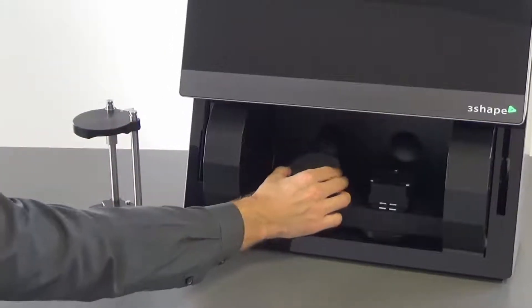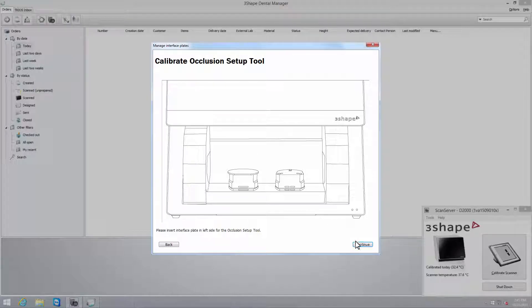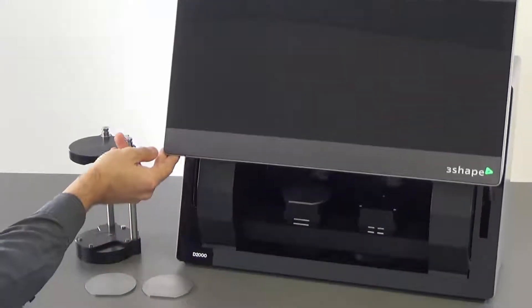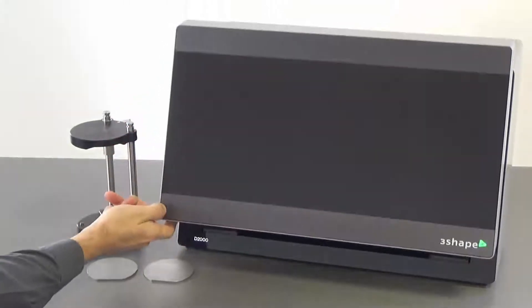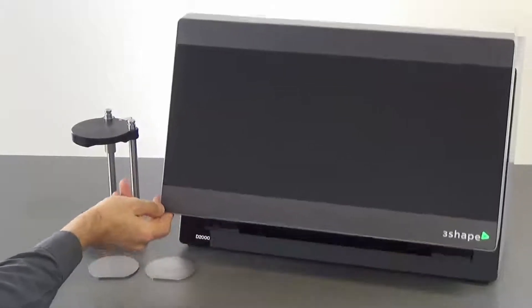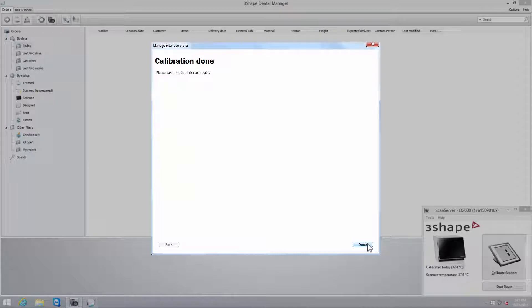When using the D2000, first set the calibration plate on the left side and click Continue. When calibration has finished, move it to the right side according to the dialog window and click Continue again. Once calibration has finished, take the interface plate out of the scanner and click Done.